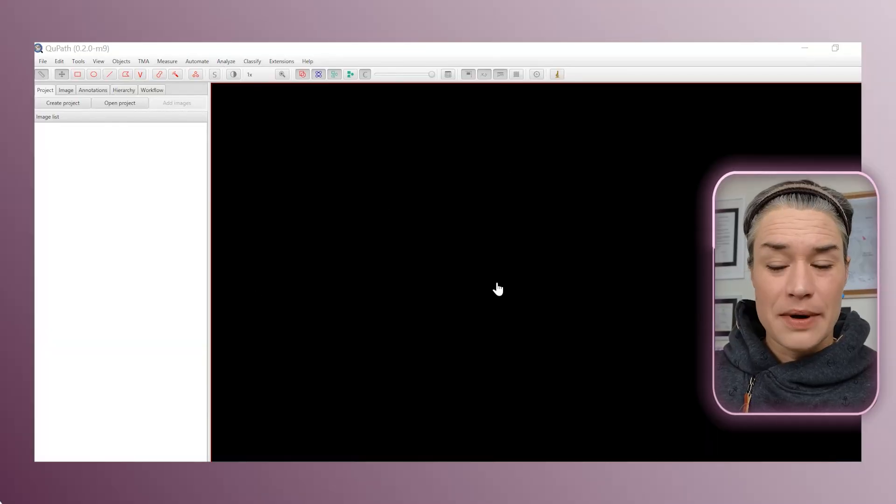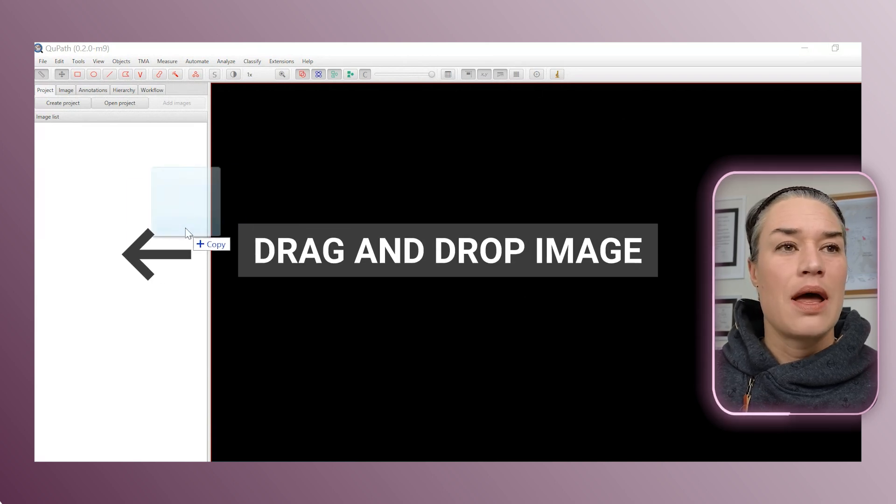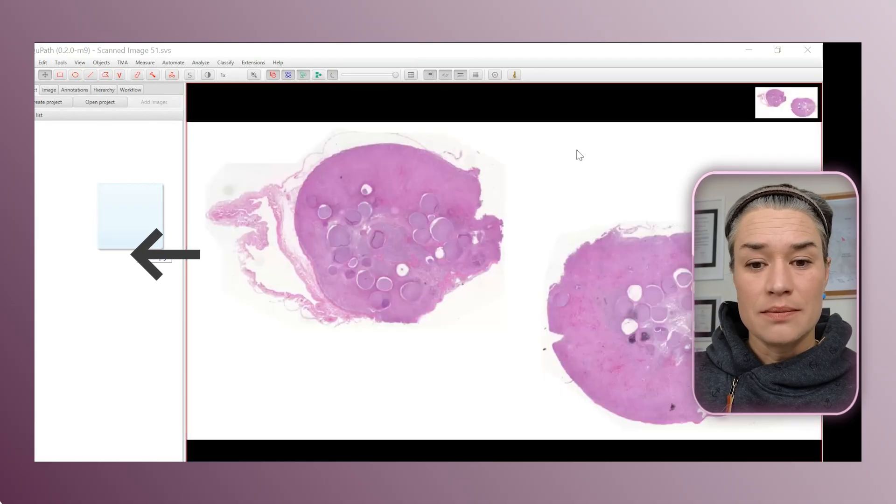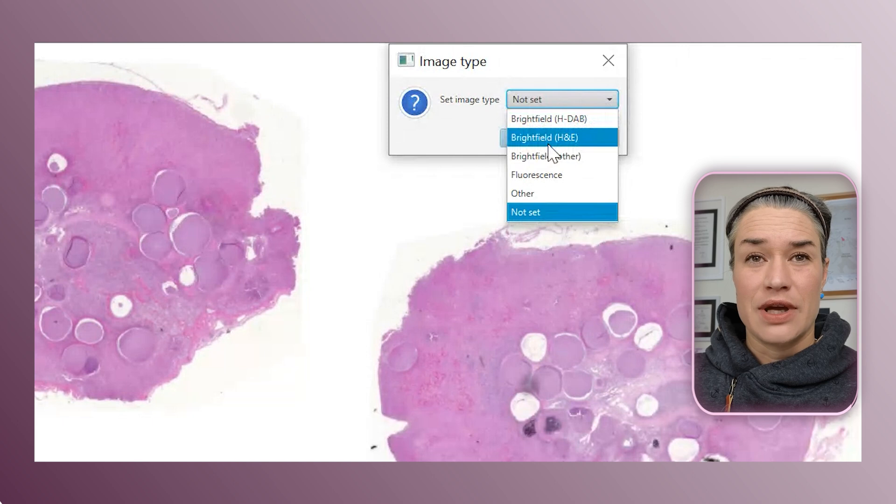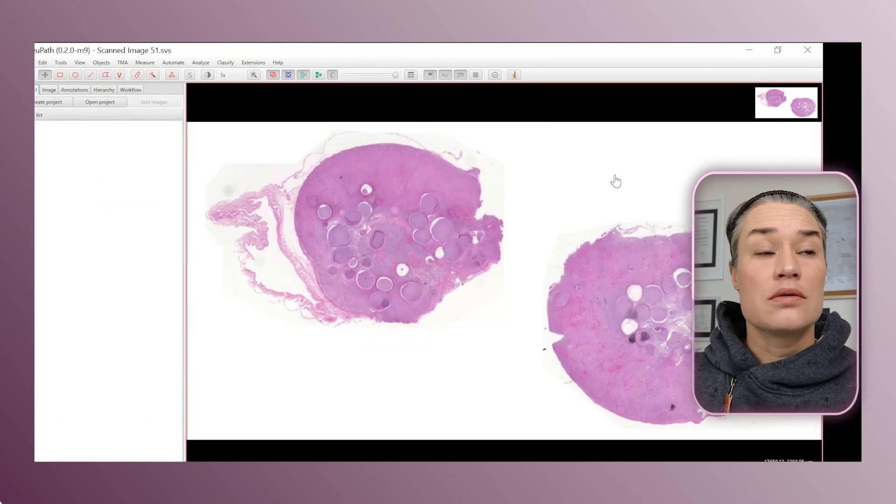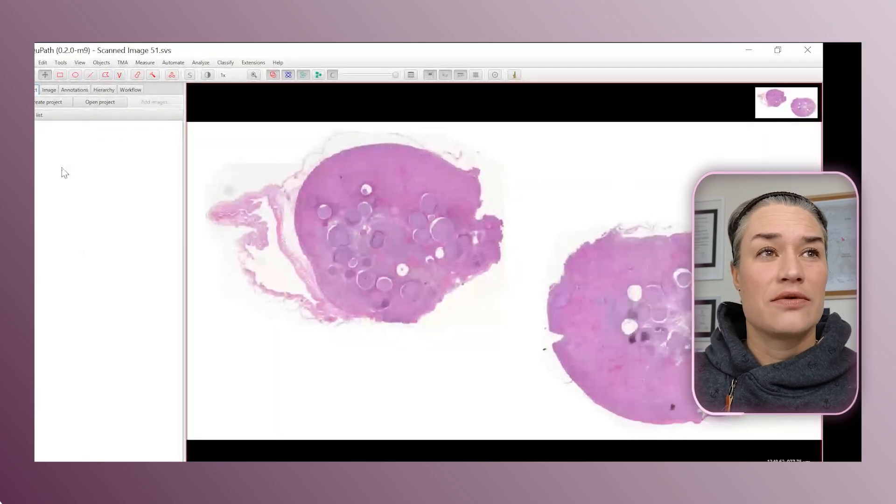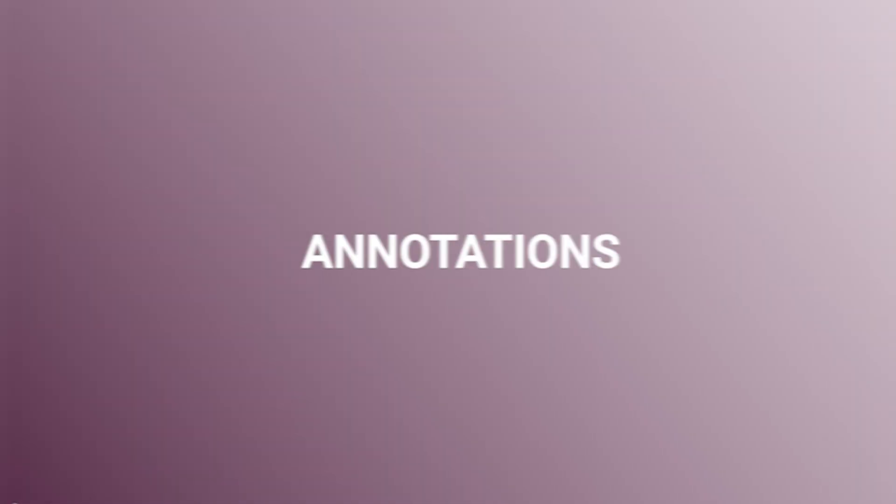Here we are in QPath and what we need to do is drop an image here. I have a few images scanned, so I can just drop one here. It's going to ask me a question about the image type. This is Brightfield H&E. If you wanted to have multiple images, you would have to open or create a project. Today we're just going to be focusing on annotations.